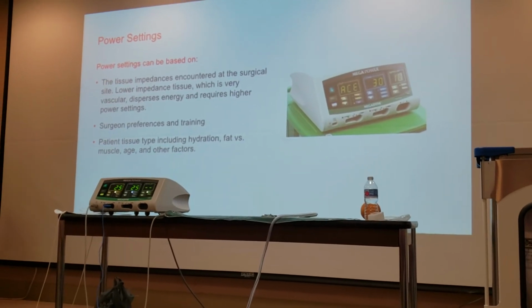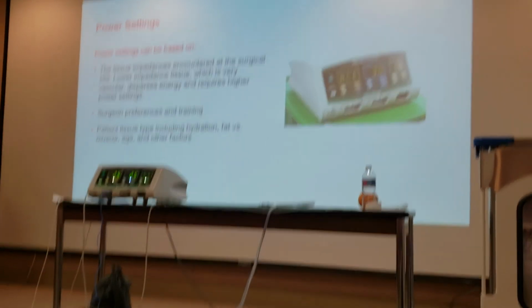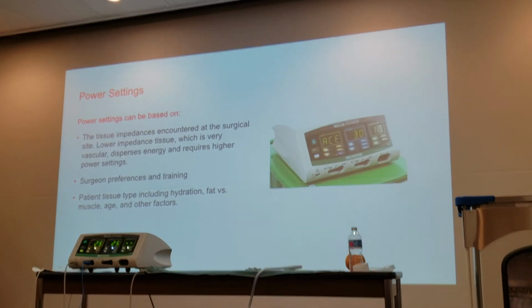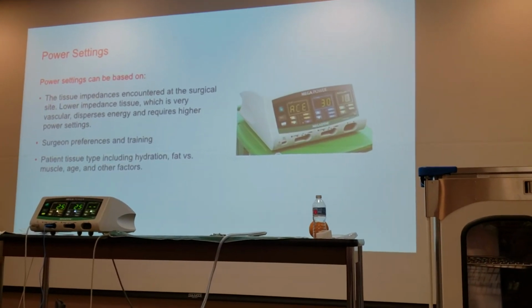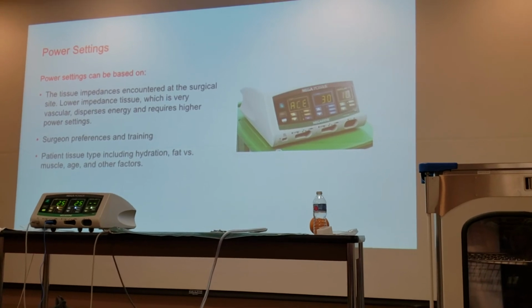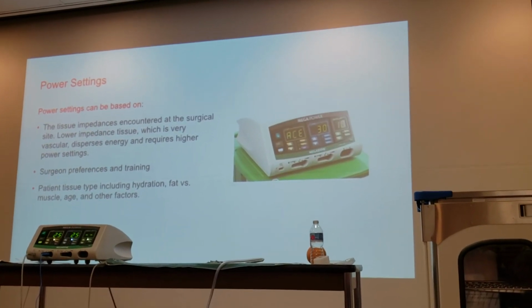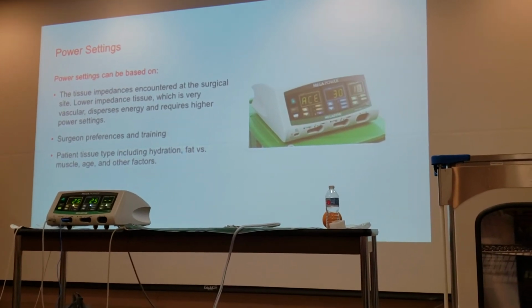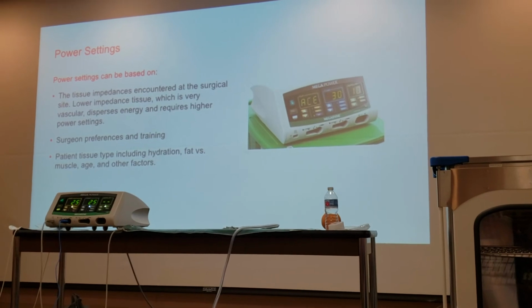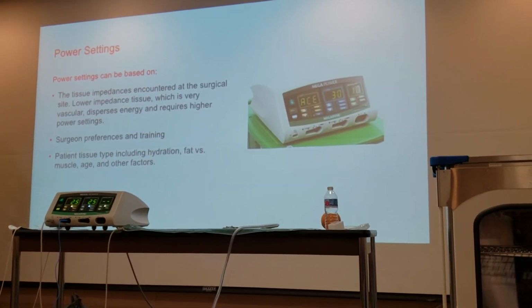I have found in my experience, the ones that understand power settings are typically plastic surgeons and ENTs. And why is that? They're concerned about what? Tissue cosmesis, right? So they tend to understand. I see breast surgeons and plastic surgeons use cut a lot more, and they understand the power settings that they want to throttle it at.